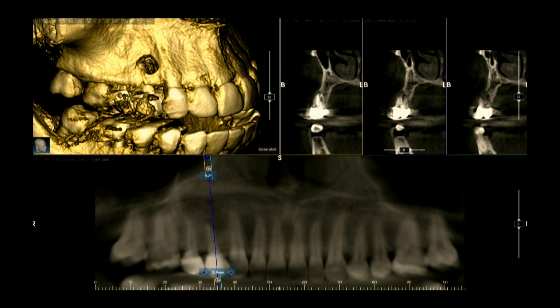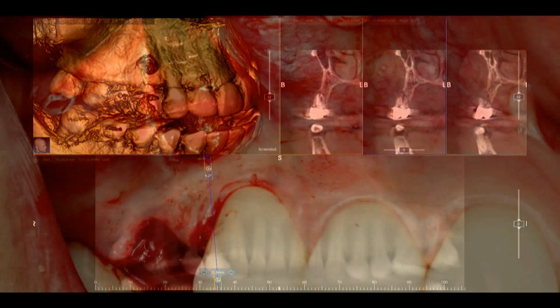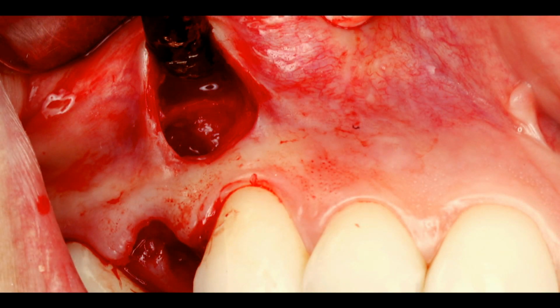So just like John, I want to do things minimally invasive, but that really means not elevating the marginal tissue, right? Not elevating the papilla if I can avoid it. And so we're always going to extract that tooth from within the socket. And John and I both use this trick quite a bit, so we put both of these in here.